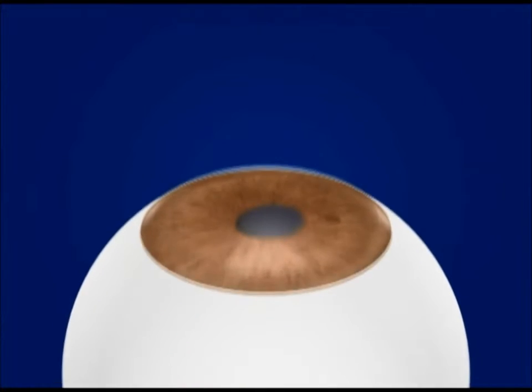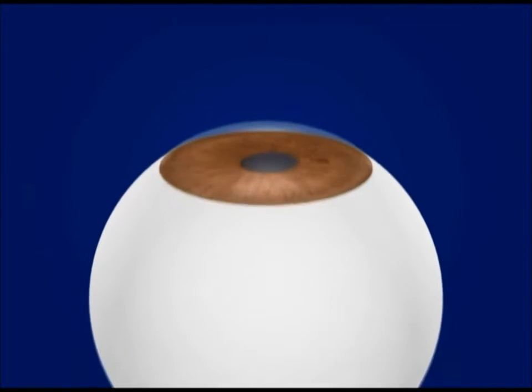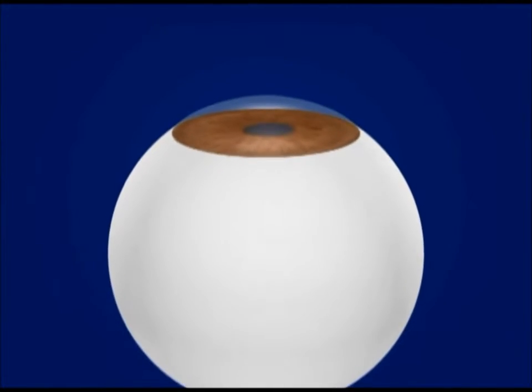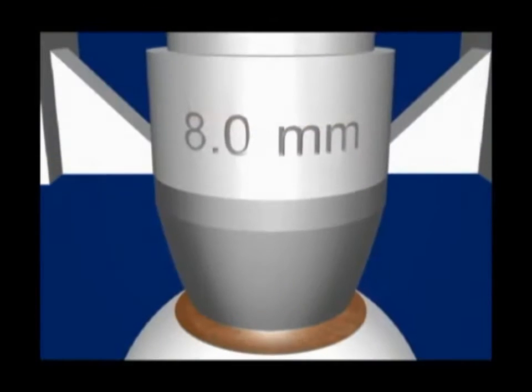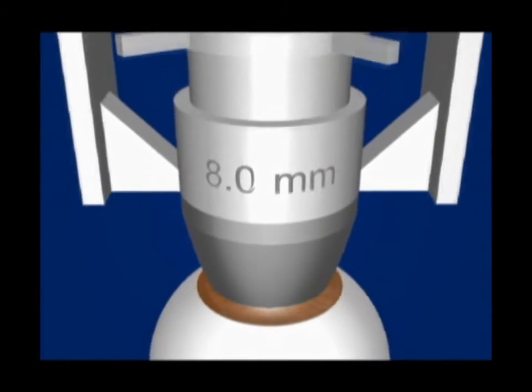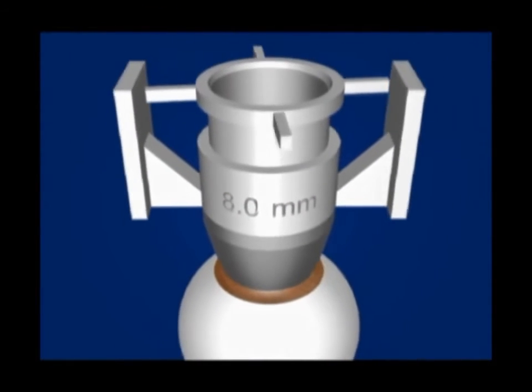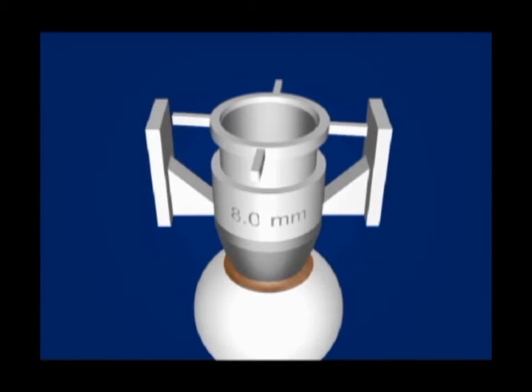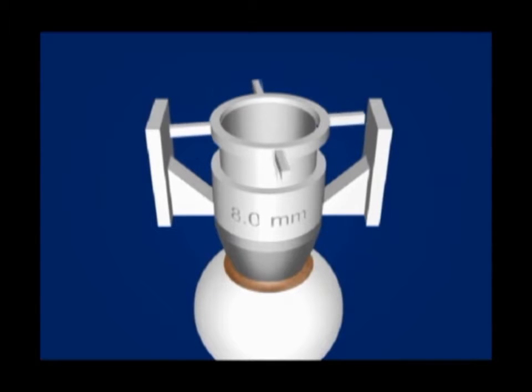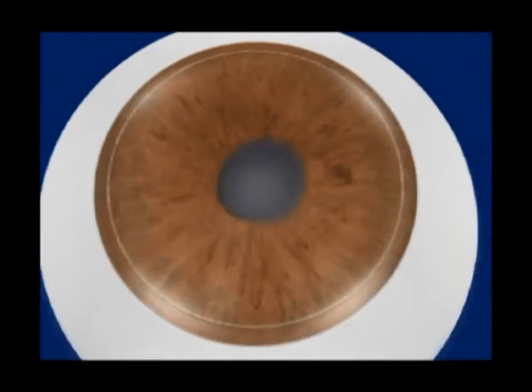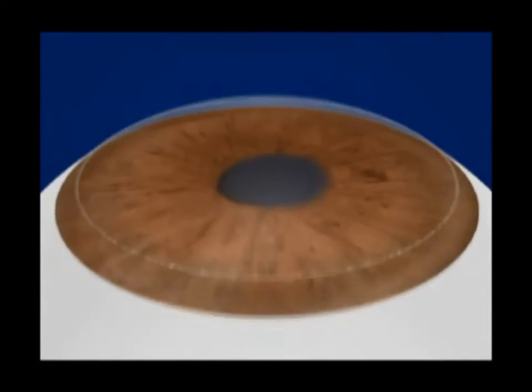Let's see how we create the donor lenticule. We begin by taking a whole globe donor eye and an eight millimeter suction trephine. A trephine is used to create a 300-micron deep groove on the corneal surface. Using this groove as a guide, the cornea is dissected with a crescent blade in a lamellar fashion.